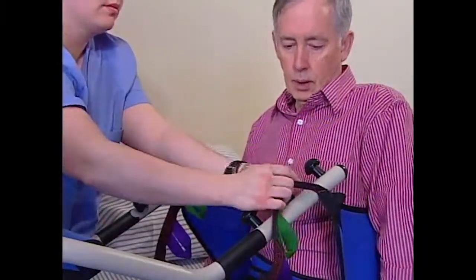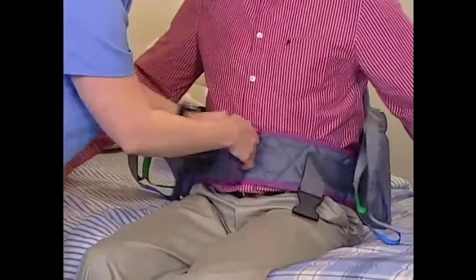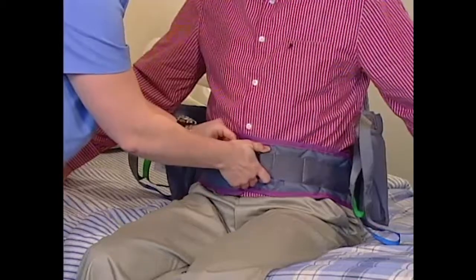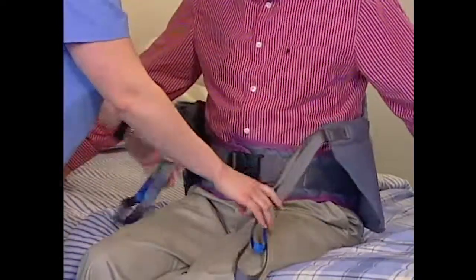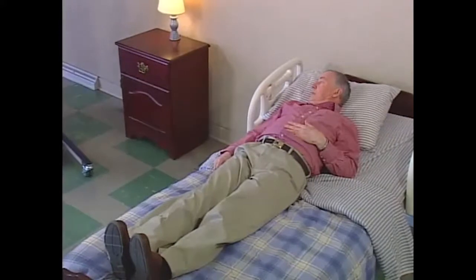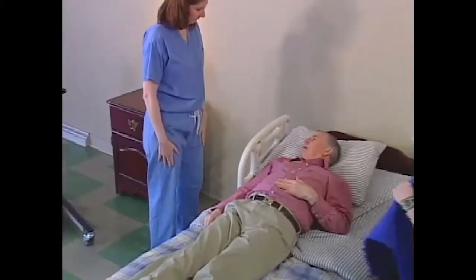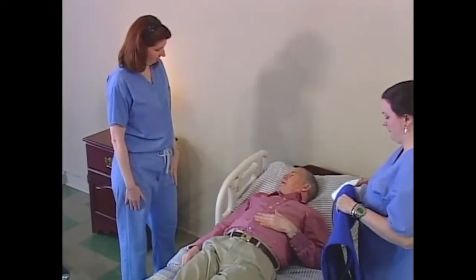It's recommended that each resident be issued their own individual sling that conforms to their weight, medical condition, and type of transfer to be performed. Before you attempt any kind of lift, make sure that you understand the resident's limitations and their ability to assist with the transfer.